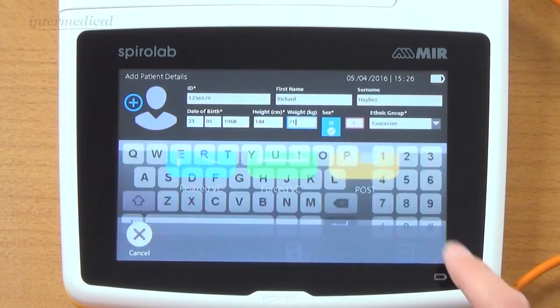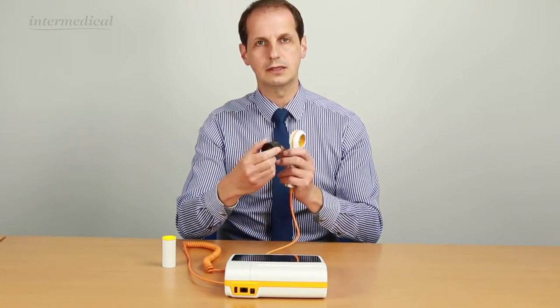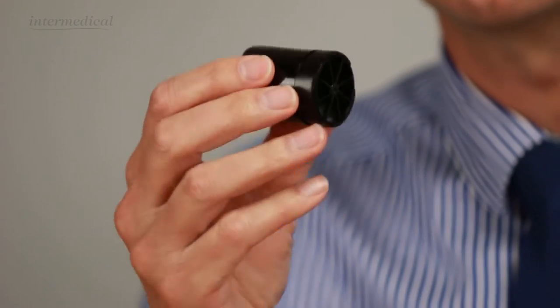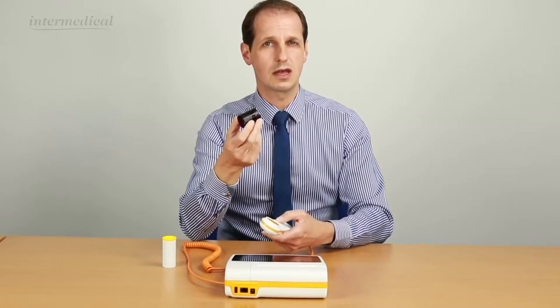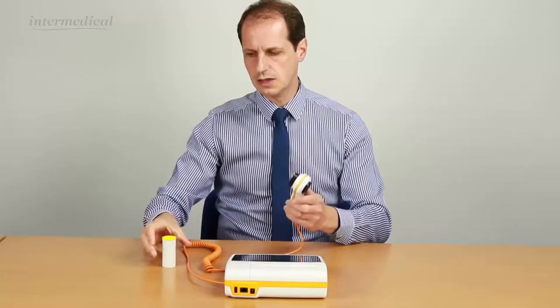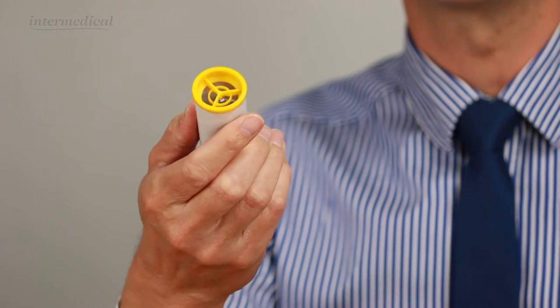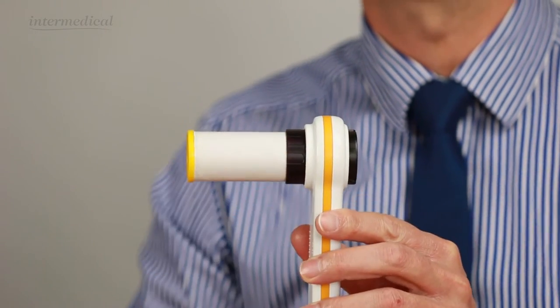I'm going to perform a test. The device itself is a turbine device - a rotating vane. You can verify this, and there's a verify facility with a 3 litre calibration syringe. This should also be cleaned and sterilized - perasafe, that sort of thing. It just pops in and twists to lock it in. The mouthpieces are the standard cardboard mouthpieces. These are one-way valve mouthpieces, but you can use normal ones - one-way valves are generally better. That just pops into the front.